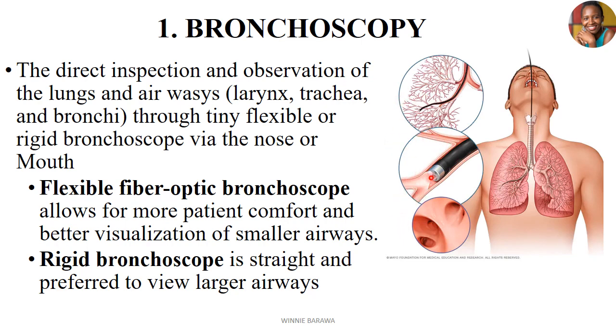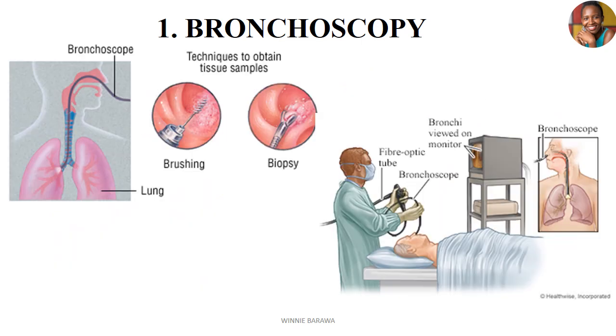So this is our bronchoscope here going in. The bronchoscope allows us to view these airways, but alongside this bronchoscope, there is a place for cameras that allows us to view the walls and how the airways generally look. And you will see later on how the whole procedure is done.